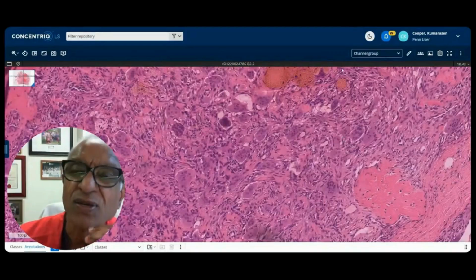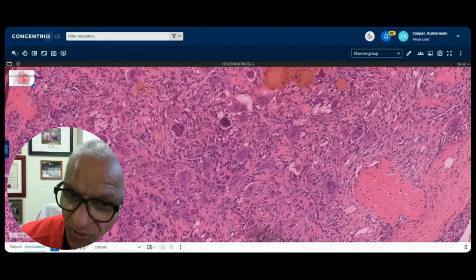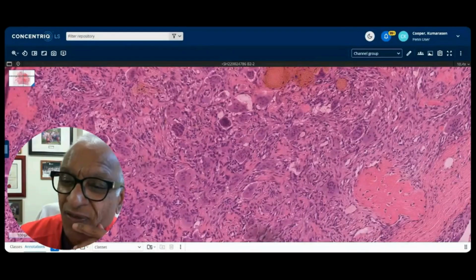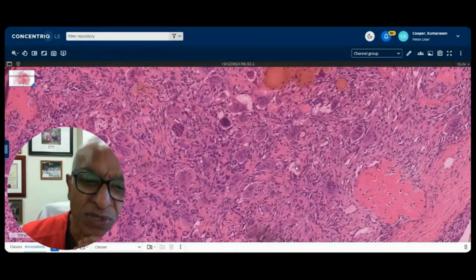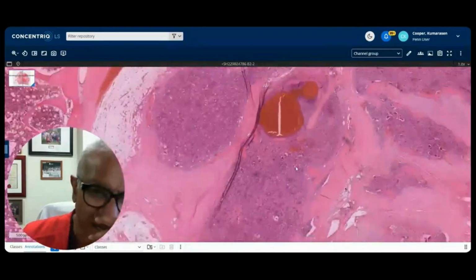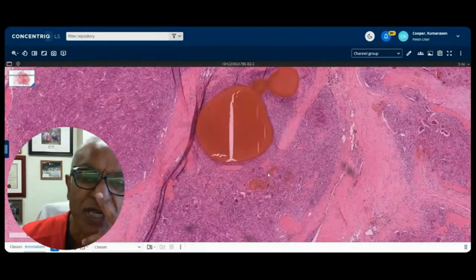I think the tenosynovial giant cell tumor is a good differential diagnosis. Giant cell tumor of bone is a good differential diagnosis. But Jan has mentioned the solid ABC. This lacks the aneurysmal changes, and remember I was showing you these sort of microcystic aneurysmal changes, if you will.